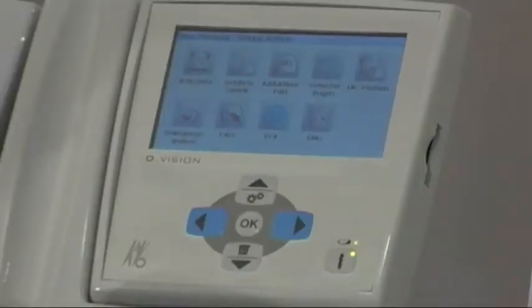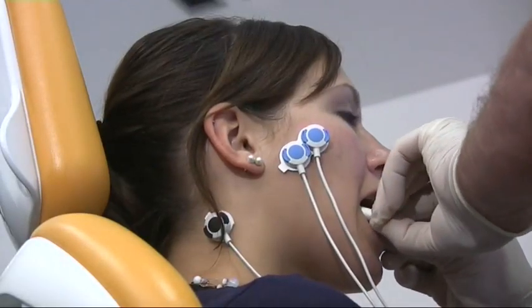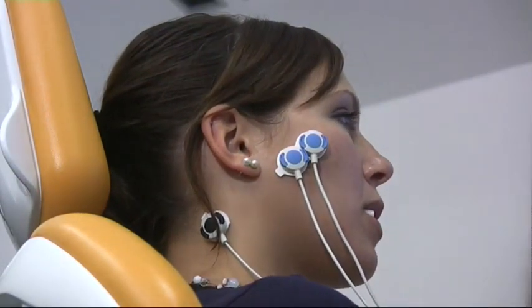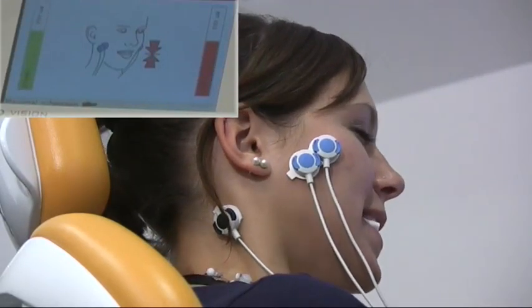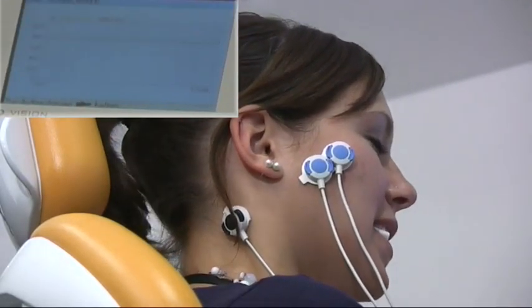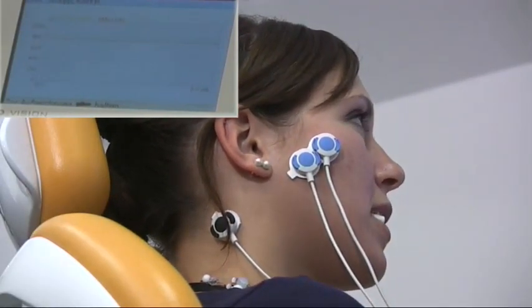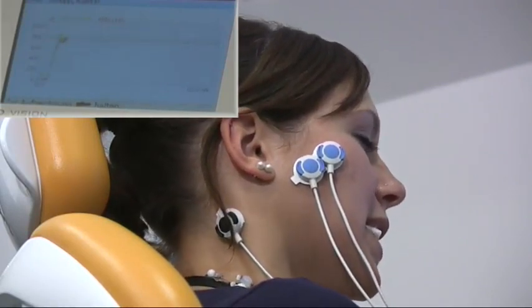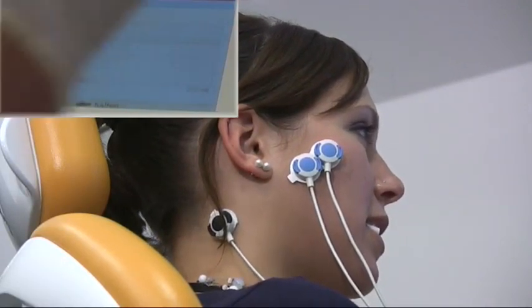We start the EMG measuring. The patient opens her mouth and has two cotton wool rolls placed between her teeth. Please bite down. The measurement is started and the patient bites with maximum power. Harder, harder, harder. I restart the measurement. The patient bites firmly once again, then relaxes.